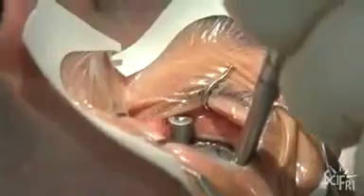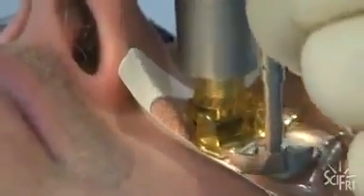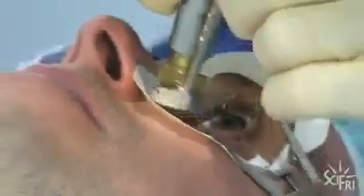To cut the flap, Dr. Vail has to secure the eye with a suction ring. Once Kathy activates the vacuum, the ring holds the eye and firms it up. And then a second instrument called a microkeratome comes across the eye and cuts a thin layer of, like, the thickness of a contact lens. Little squeeze. So really what you're doing is you're doing two procedures. One, cutting a flap, and the other one, performing ablation of tissue with a laser.